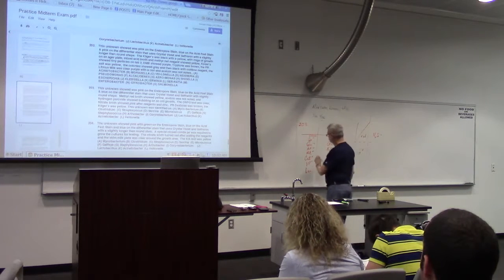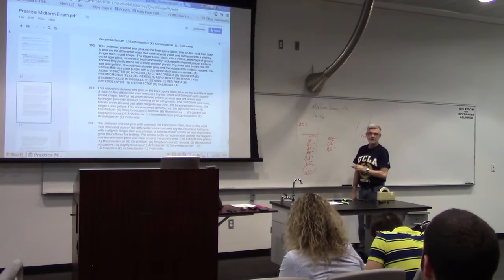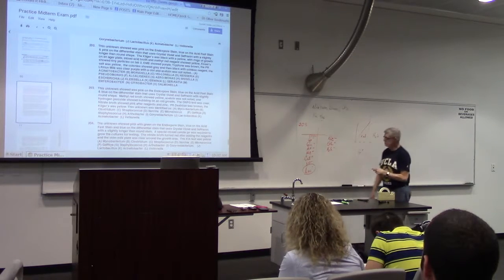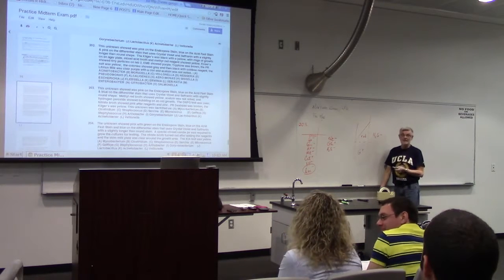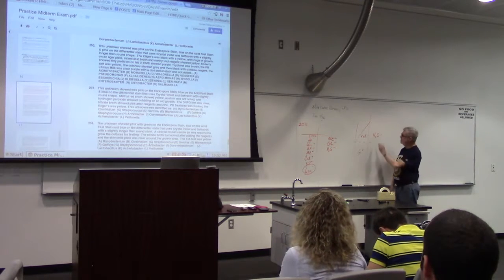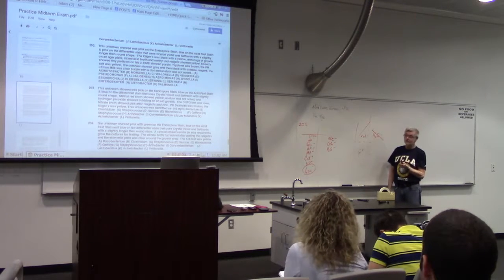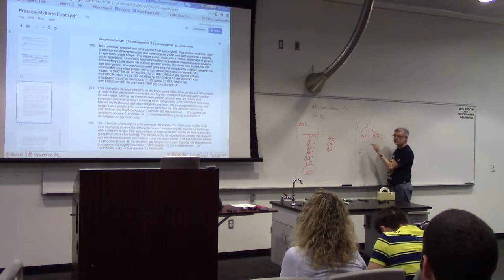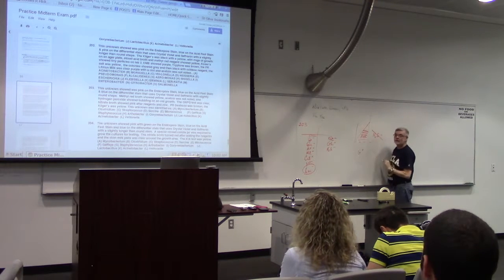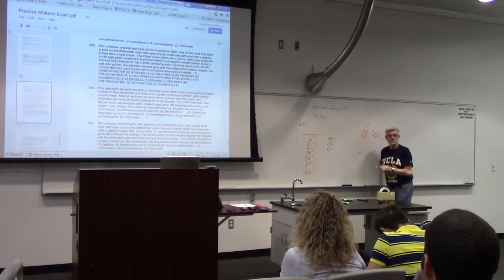Okay, I'm lost. I'm sorry, I'm lost. We already told you lactose was negative on the ONPG. If lactose is negative and the tube in Kligler's has yellow, but it doesn't tell you what the other colors are, you know black is not mentioned, so it's not hydrogen sulfide. You already know that that tube has to have a red lactose because you already know it's lactose negative. So the red is here, so where can the yellow only be? Here. So that's glucose positive.